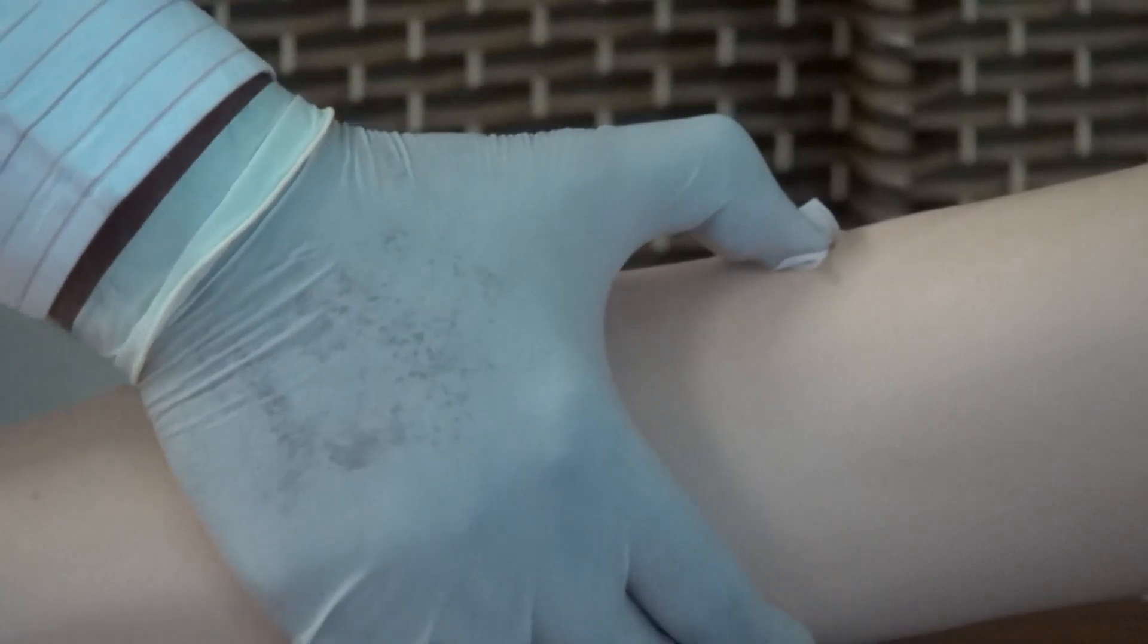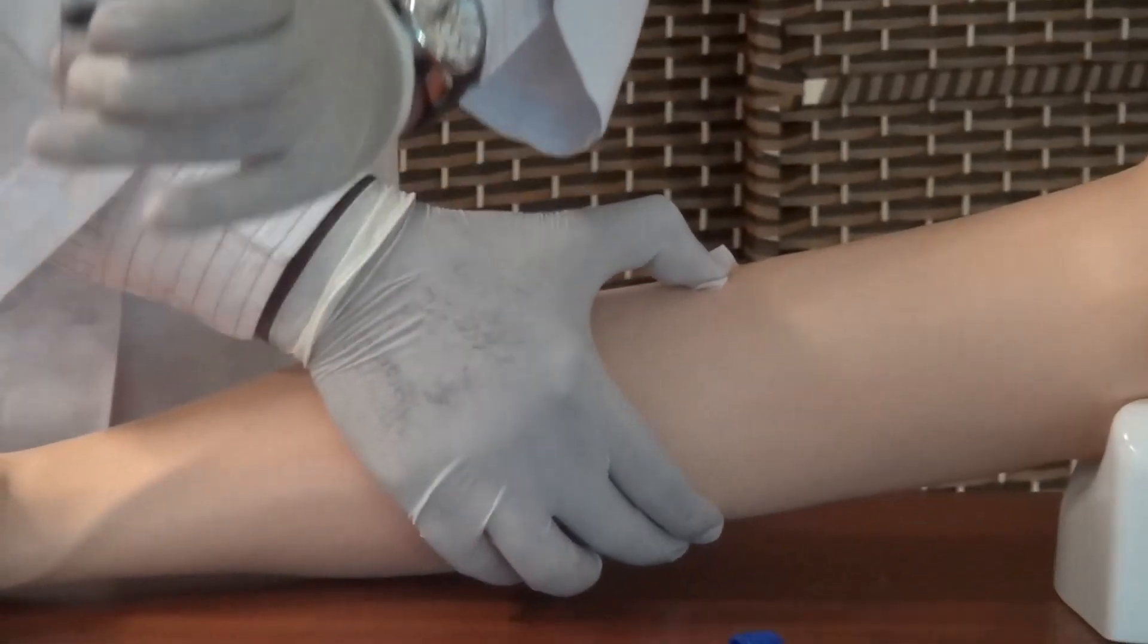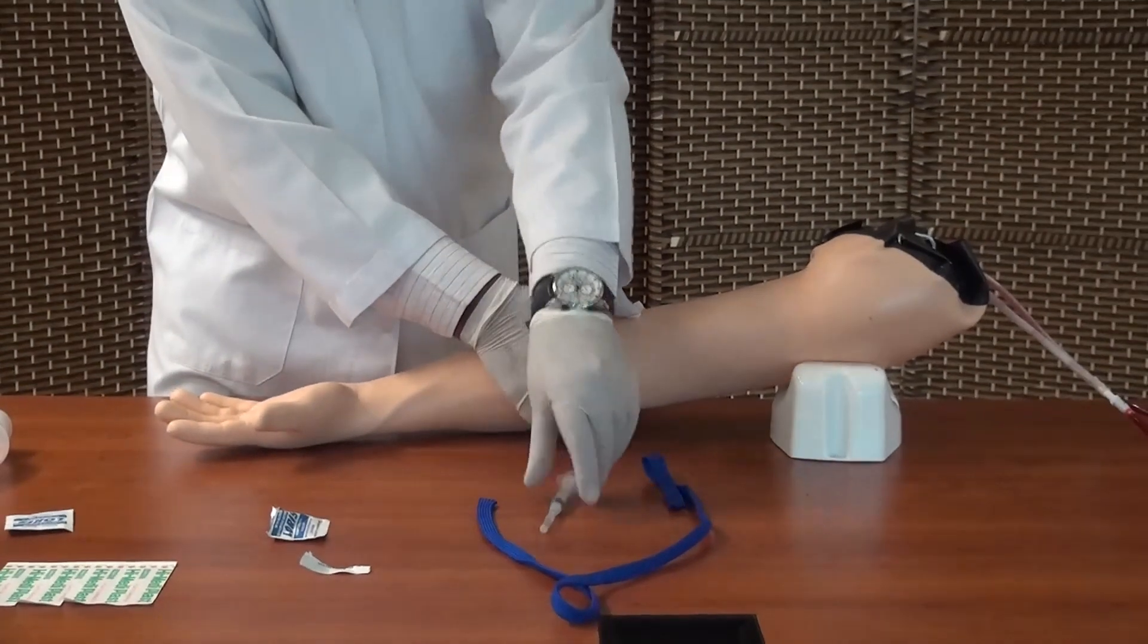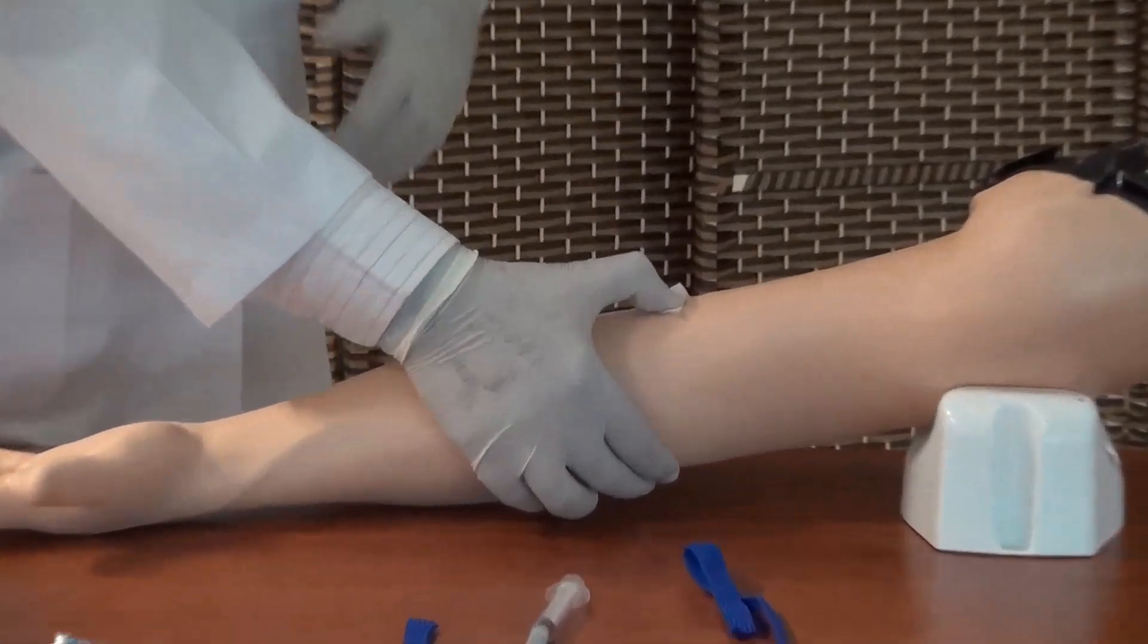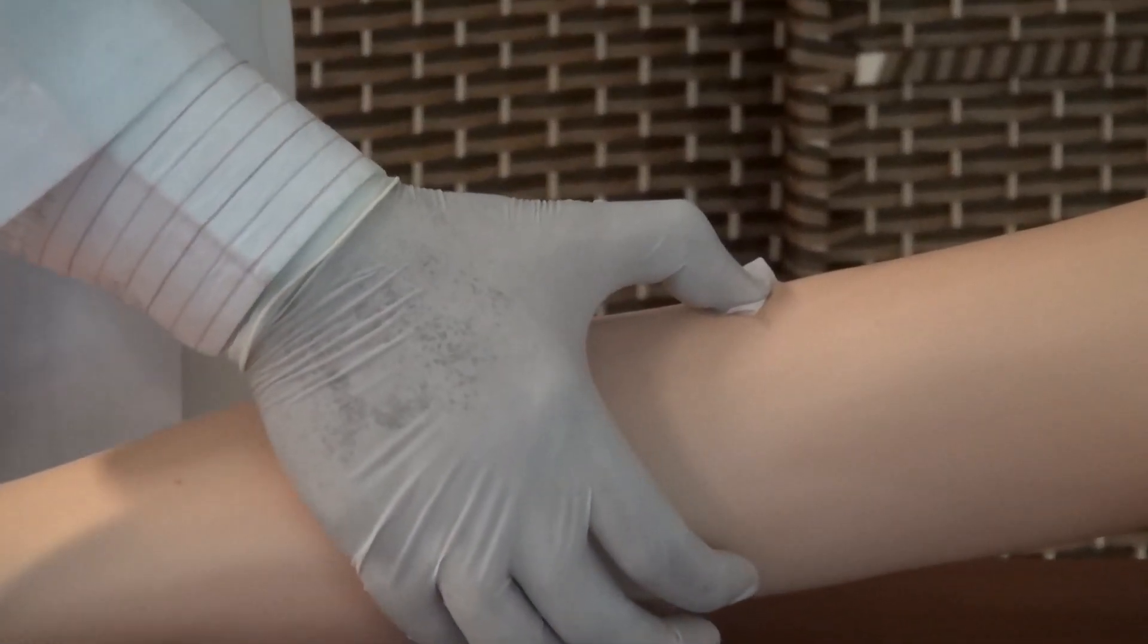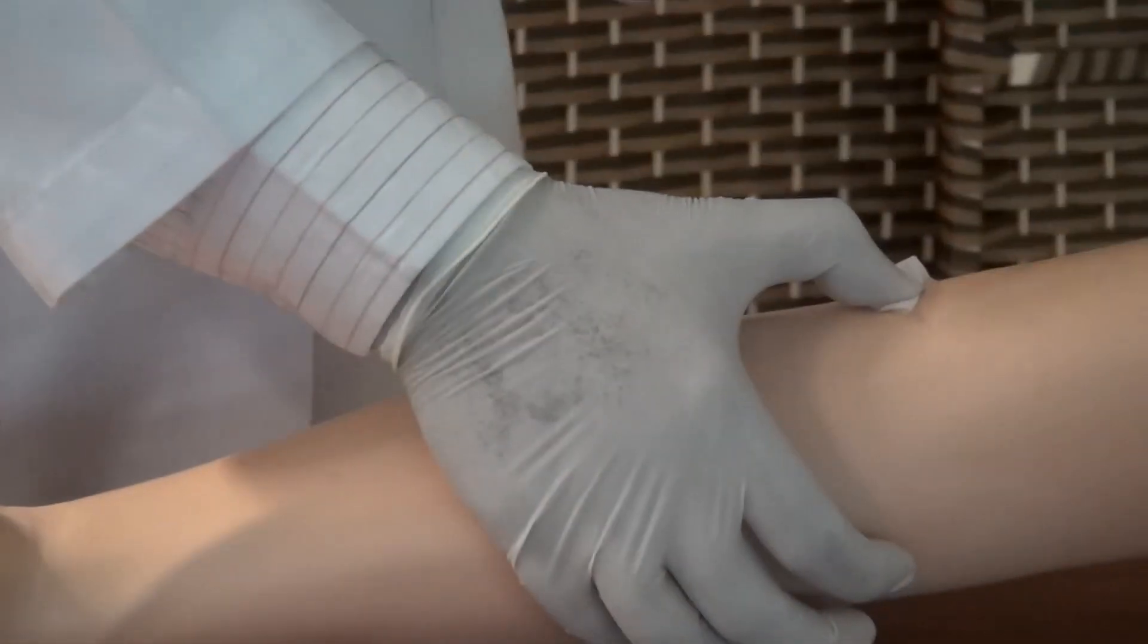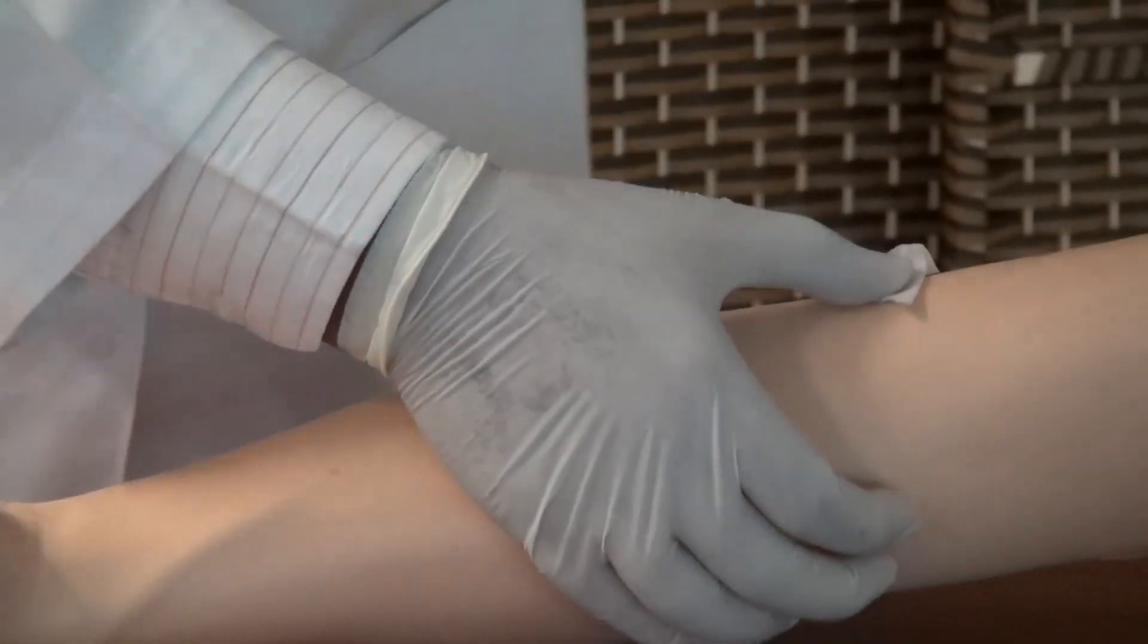Take it out. Apply firm pressure and keep it pressed firmly. Now, if you have got a sharps container, dispose the needle instantaneously. Otherwise, carefully cap it and place it for later disposal. Once it has a few seconds under firm pressure, then I think that's sufficient enough. Now you can leave it there. There is no bleeding, so it's already done.